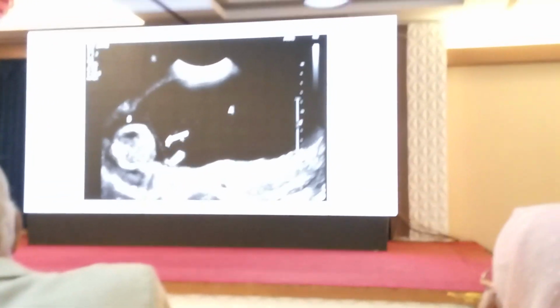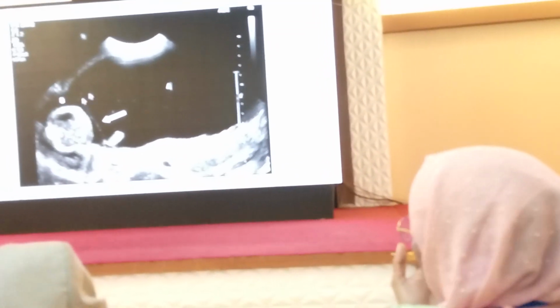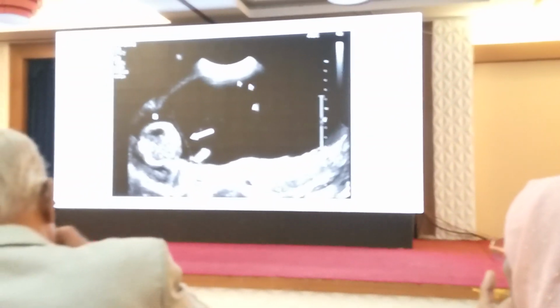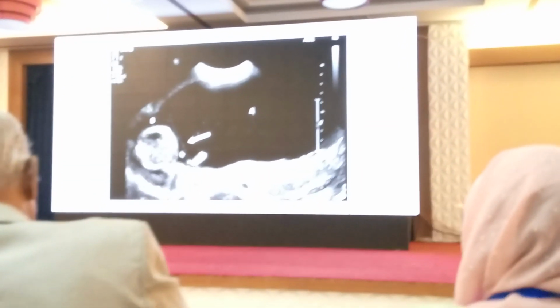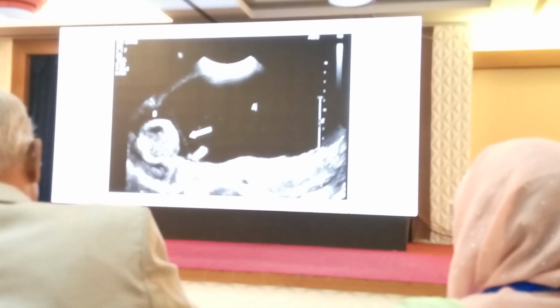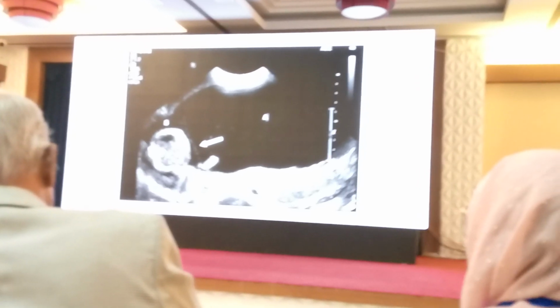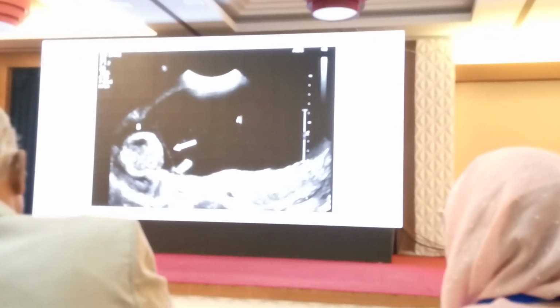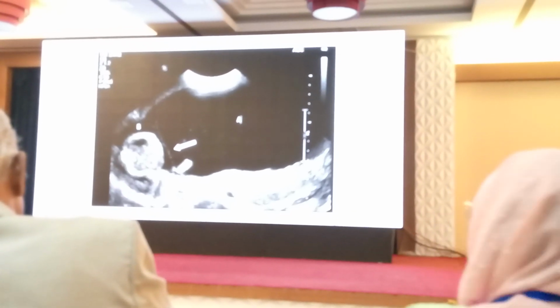So you can see here, you can see the membrane, yes? See the difference? Not much fluid, almost, and here there is lots of fluid. So this is the early stage of twin-to-twin transfusion: oligohydramnios, polyhydramnios. I don't know if it's stage 2, because I cannot see the bladder, I cannot comment on it, but at least definitely it is maybe stage 1, unless we spoke about growth discordance with one having structural abnormalities.